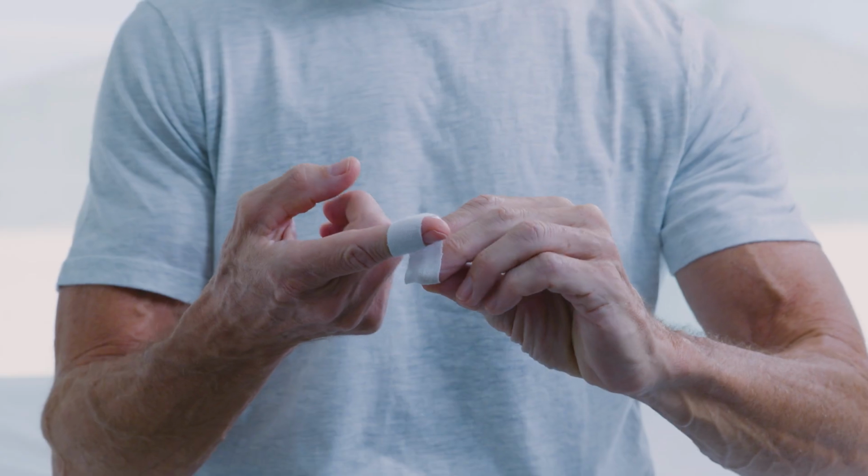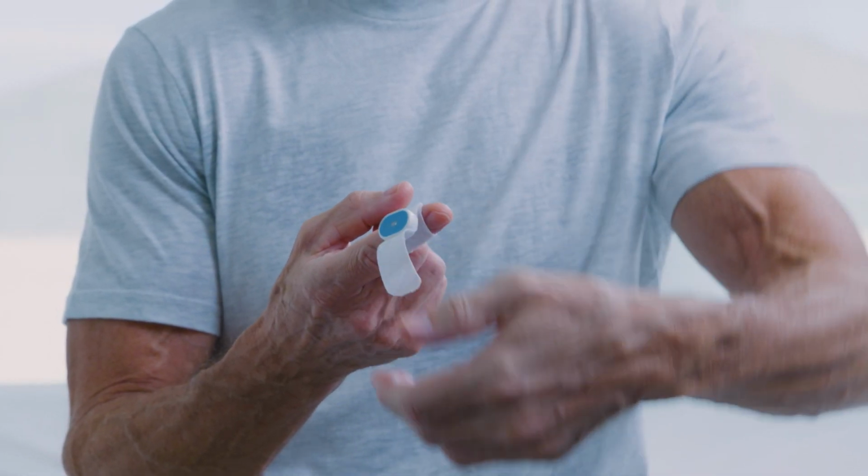After testing, keep your sensor. Don't throw out your sensor. You may need it for treatment follow-ups. Keep it and your extra adhesive strips somewhere clean and dry.